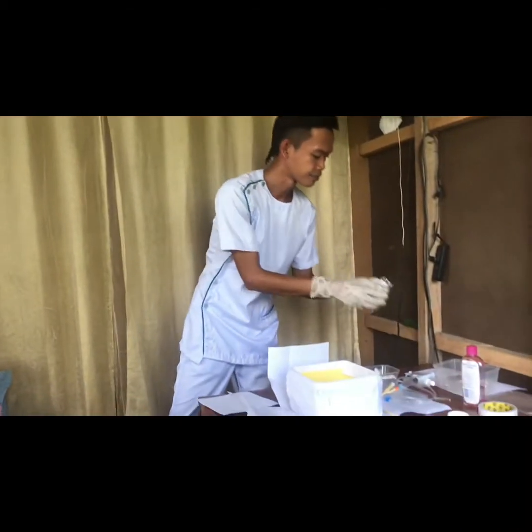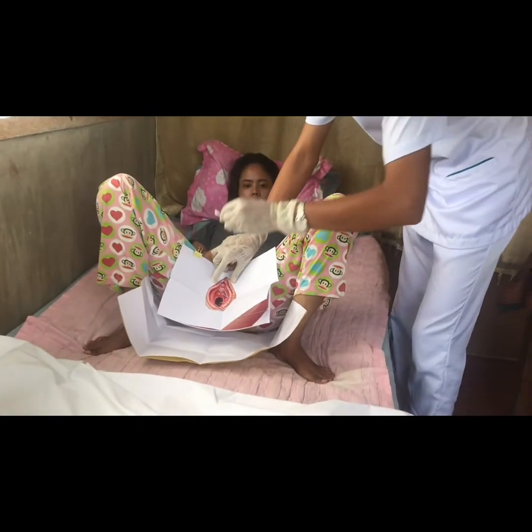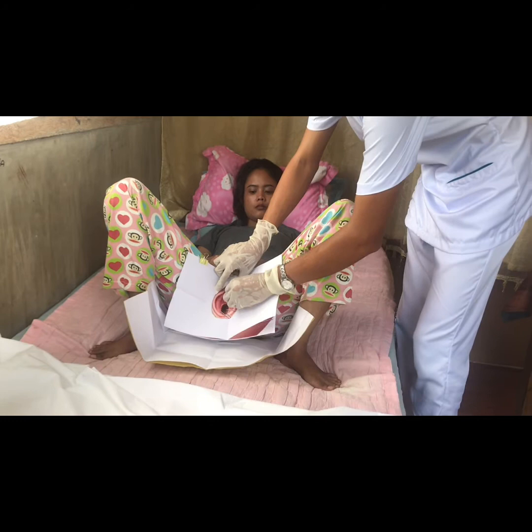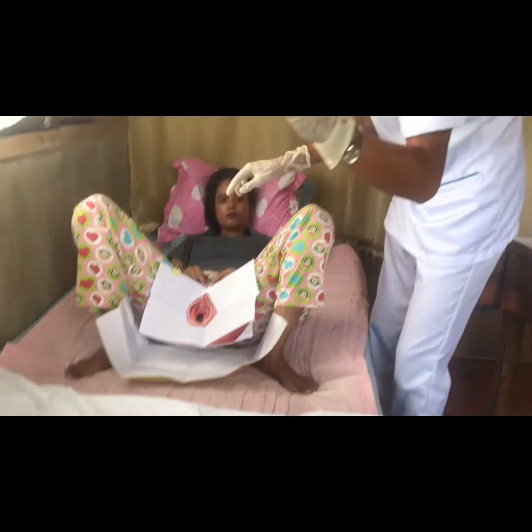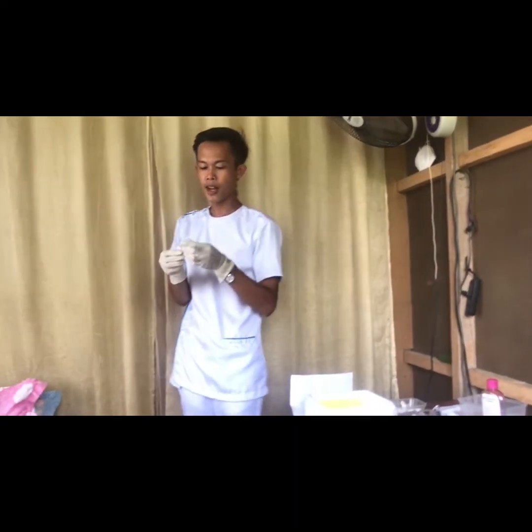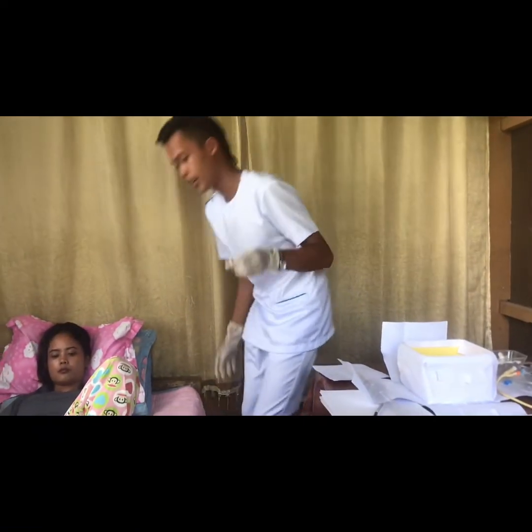Next, we have the second round of the alcohol swab. I'm going to dispose and then spread the labia and then clean the left and right portion of the labia. And then we're going to dispose of it. And then for the last alcohol swab that we have, all you have to do is to clean the middle portion of the labia.